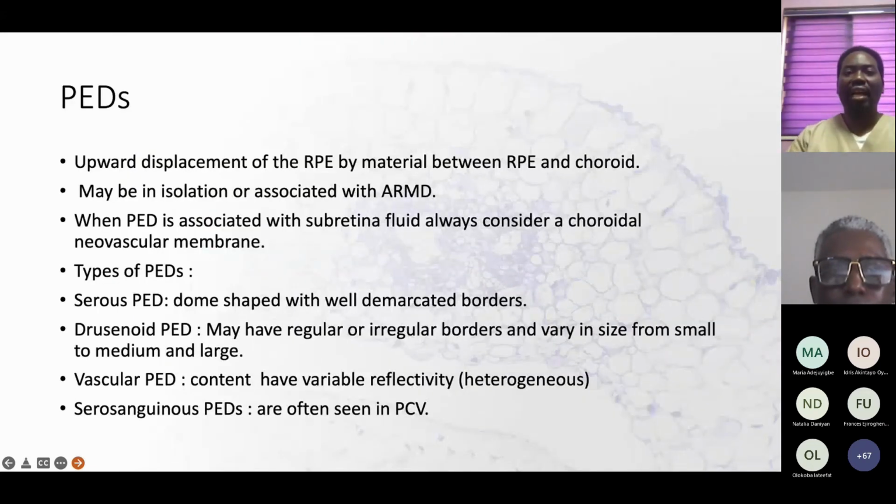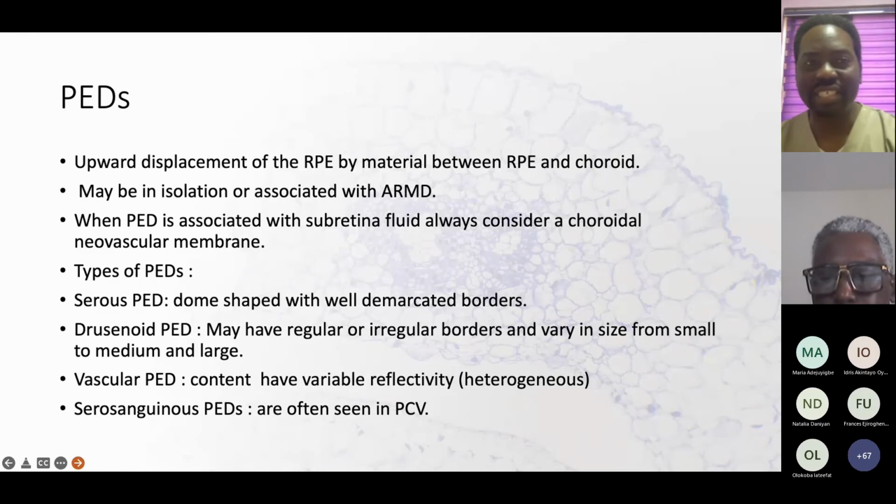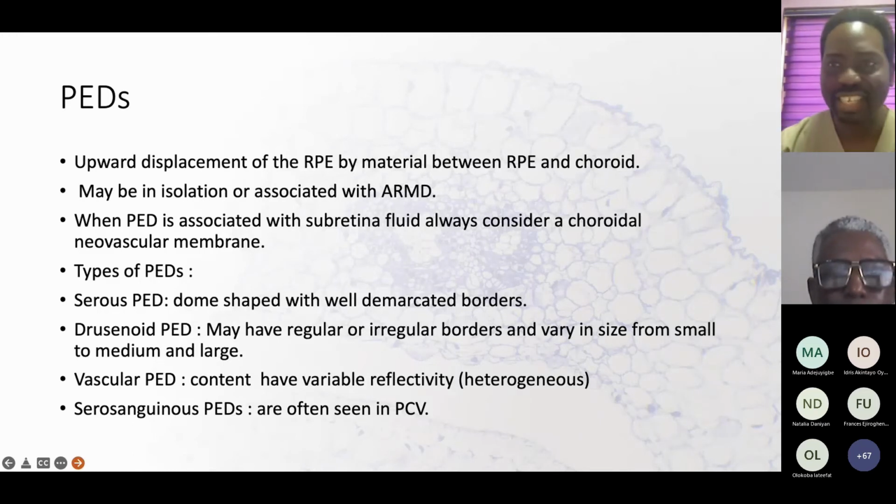So I want to talk about pigment epithelial detachments. I hope I'm not moving too fast.